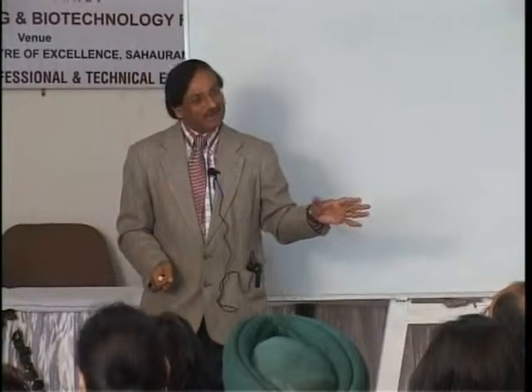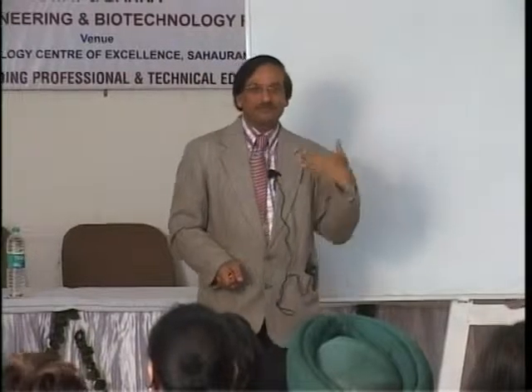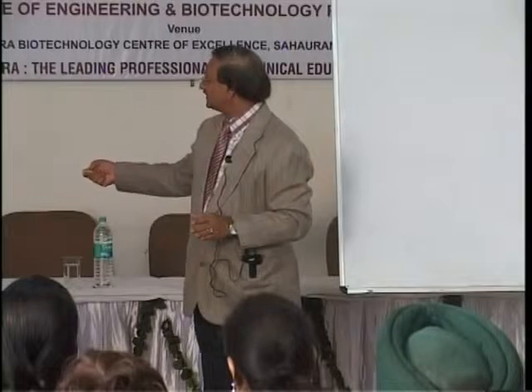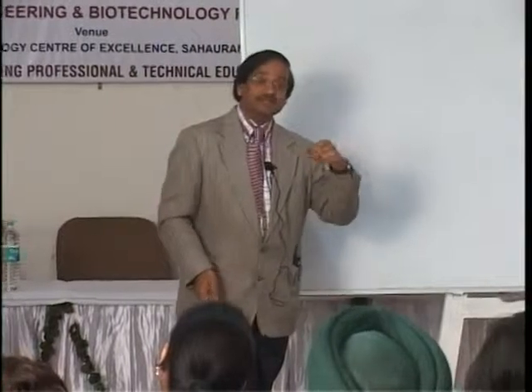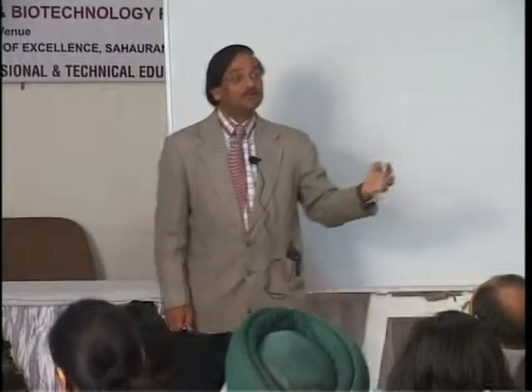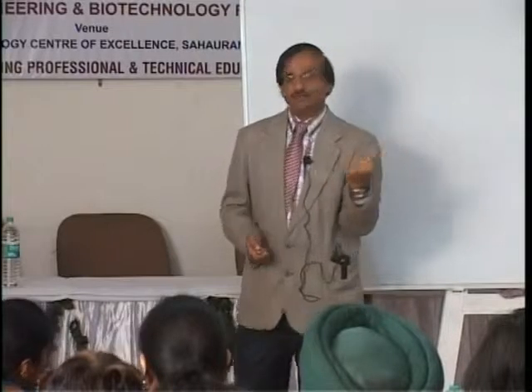So for a patient who had a known cancer somewhere, whenever there is an abnormal uptake, the fear is whether there is any recurrence or the disease has come back. So from this fusion imaging, it's very clear that this is a normal muscular enhancement. So it goes from one end, giving a pathetic diagnosis to a patient, to a normal finding, which is very hopeful. So this is what fusion imaging can deliver.